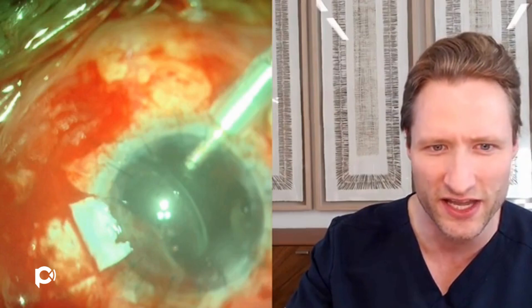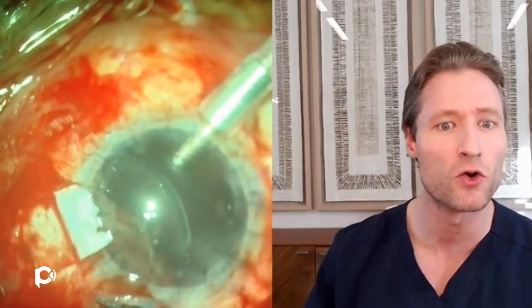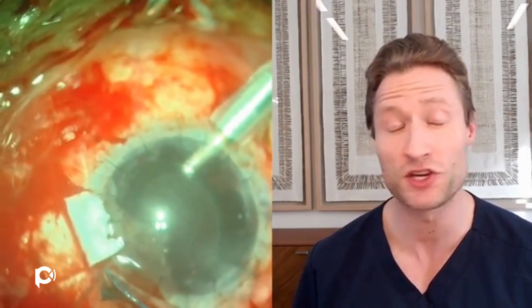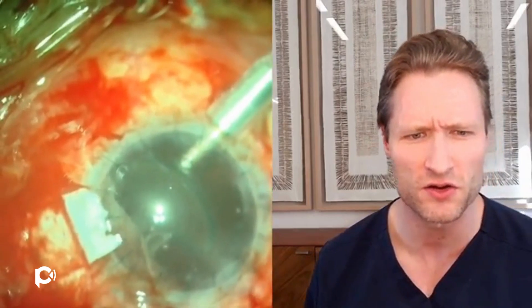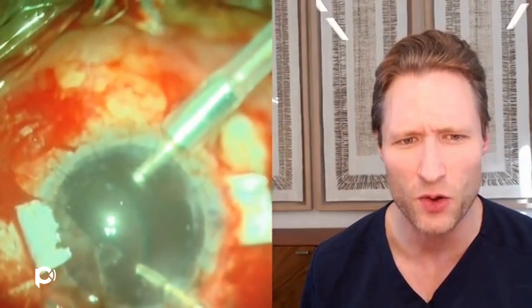As I do that, I encounter the lens. Interestingly, this lens turns out to be a three-piece lens already. This patient had previously had cataract surgery many years ago. This is an eye with advanced keratoconus — an extremely steep and thinned cornea — and this IOL was placed for that degree of keratoconus. Since then, it's had a penetrating graft, and now that IOL is grossly the wrong power. So even though it's a three-piece lens and could conceivably be refixated to the sclera, the corneal power has changed since implantation. We still can't drop it into the back of the eye.